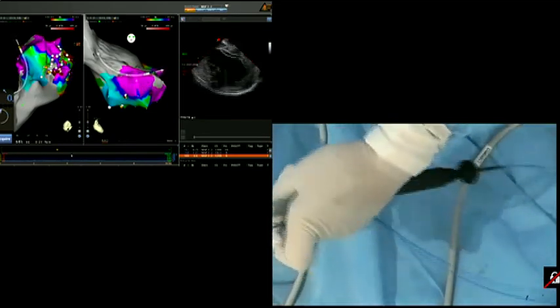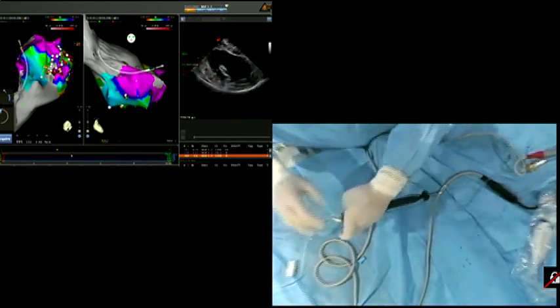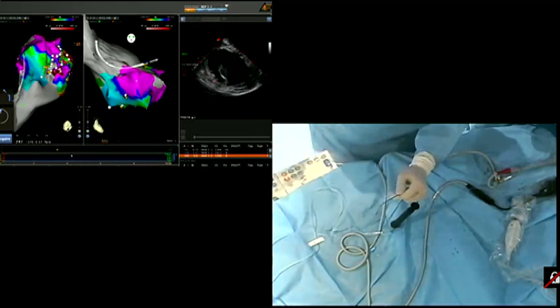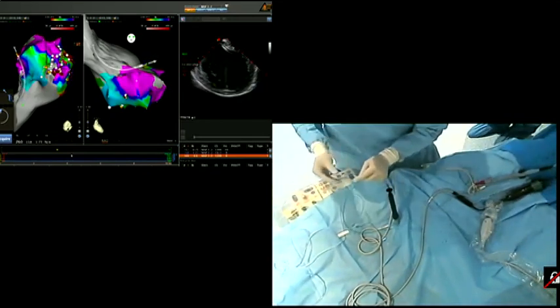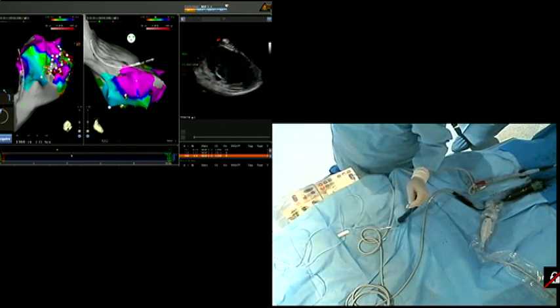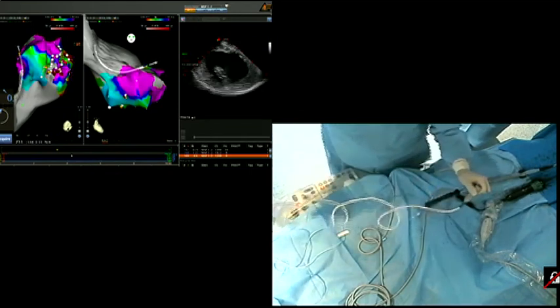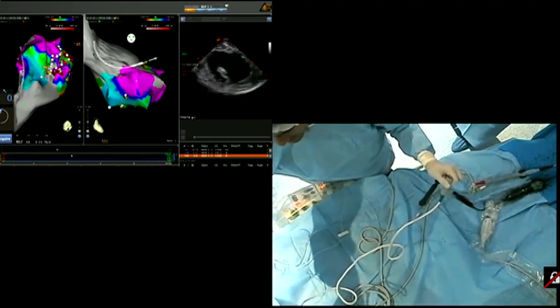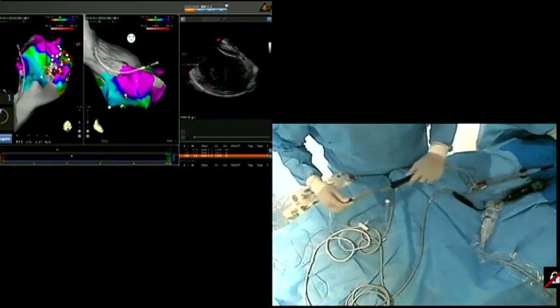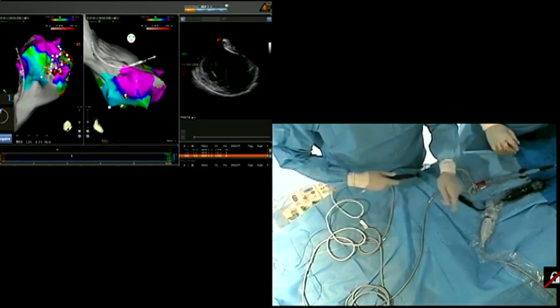The penta connector. Let's wash. We also use the pentarray often in ablation of atrial fibrillation, and we get better density mapping. However, when you use pentarray, the problem is that the techniques of atrial fibrillation based on the circumferential catheter are no longer feasible. And sometimes to verify the isolation of pulmonary veins with the pentarray can be somewhat difficult.